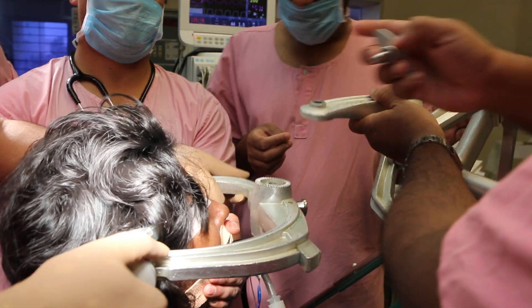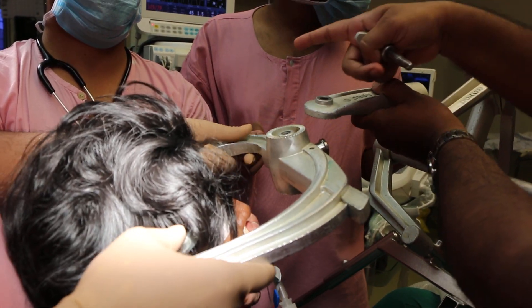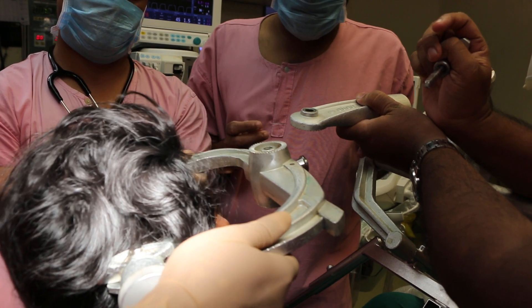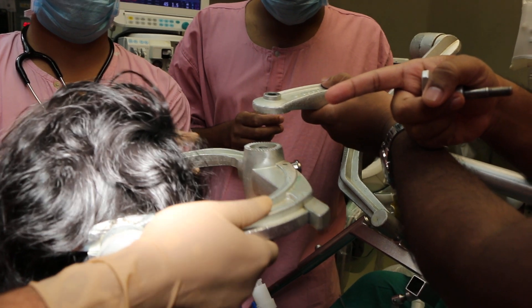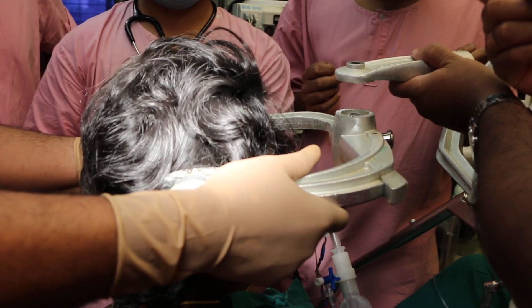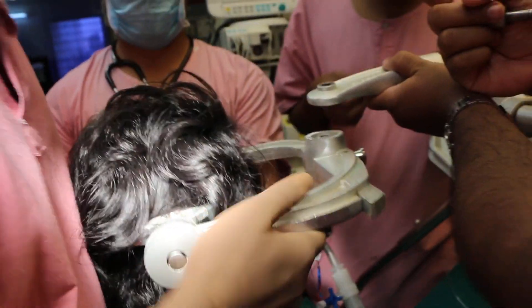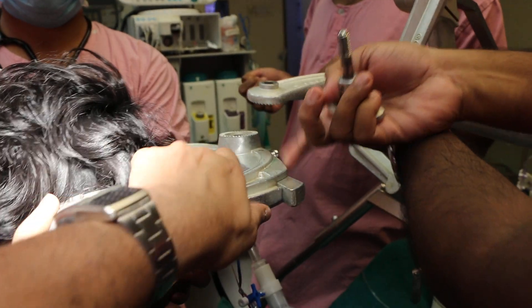We are going to adjust — there is a lock — we are going to adjust the position up to the throat. So now we are going to adjust the final position. You will see what you want to operate. So it should be in flexion, the head turned towards that side. Okay, we will see that in greater detail.